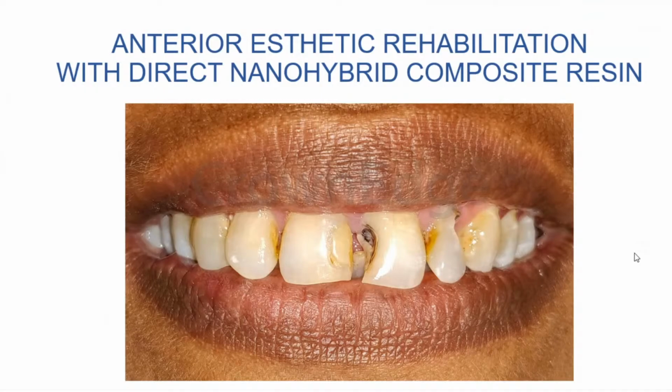So there are different ways of approaching an anterior case, right? So when there is some kind of an aesthetic rehabilitation required in the anterior segment, you have different materials you can choose from, different techniques you can choose from, and different kind of skill sets that you can have. So let's just do the treatment plan for this patient.